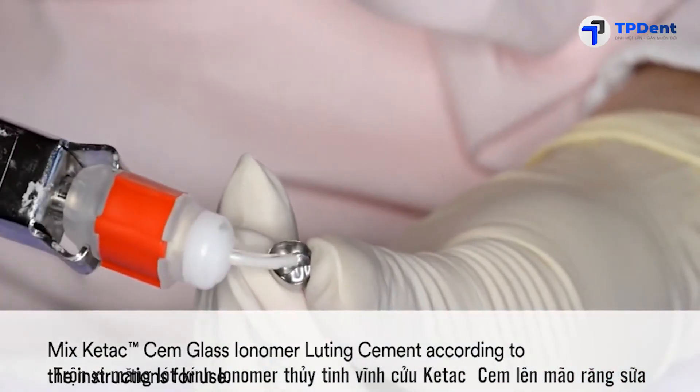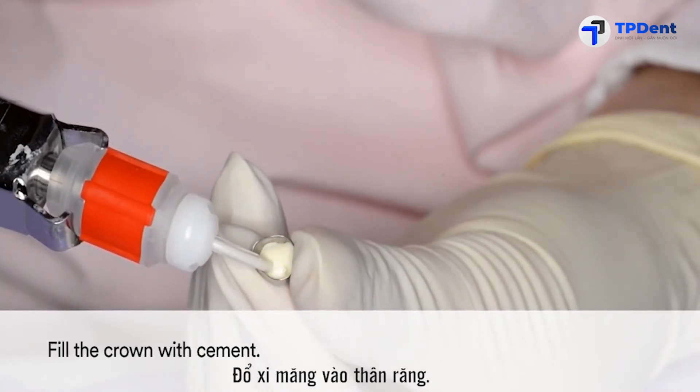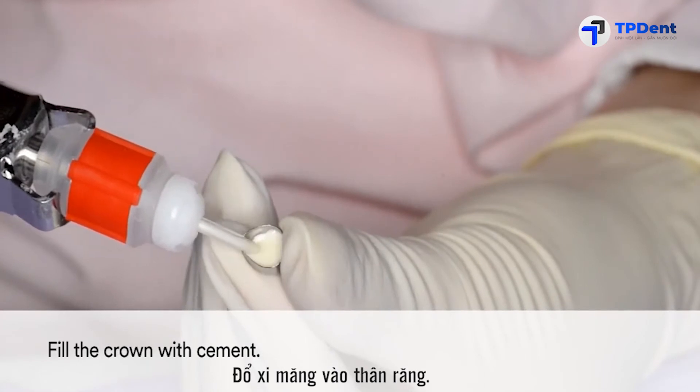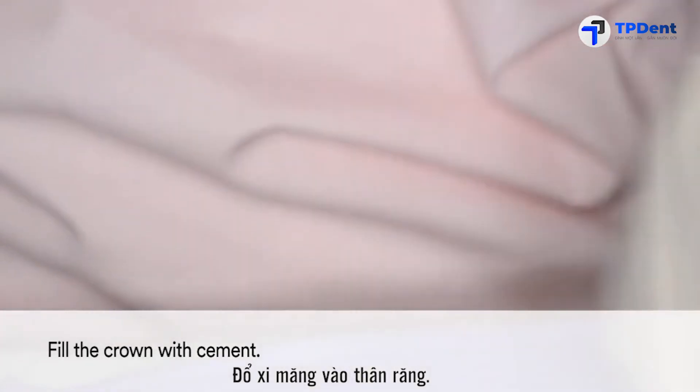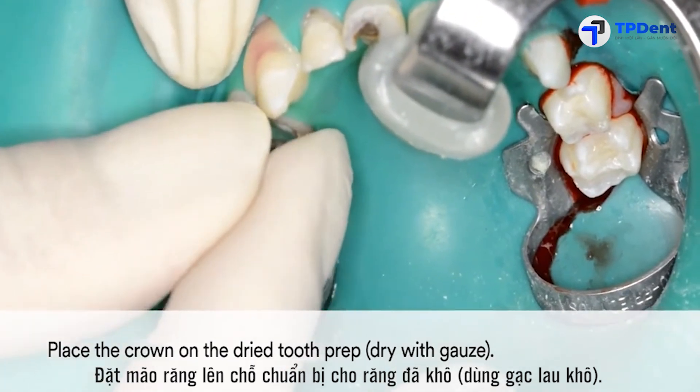For cementation, mix Ketac Cem glass ionomer luting cement according to the instructions for use. Fill the crown with cement. Then dry the tooth preparation with gauze and place the crown.